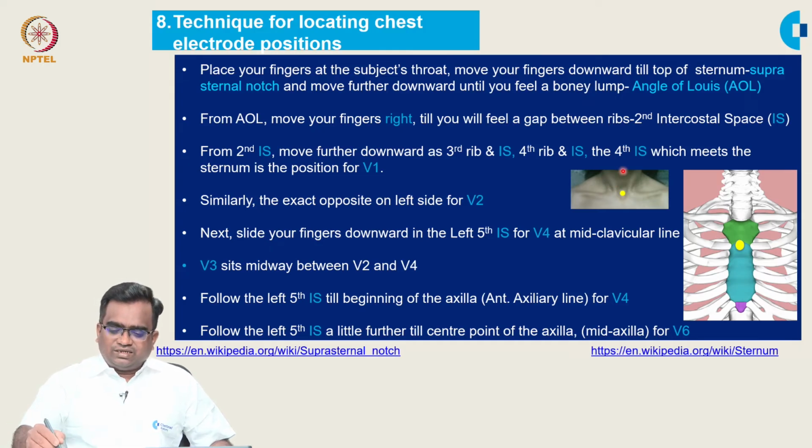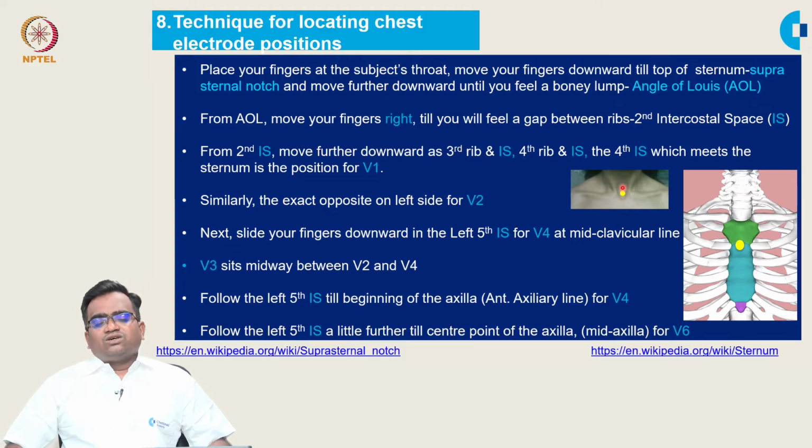From there the healthcare provider slowly comes down and can feel a notch, the yellow colored area, which is called the suprasternal notch.